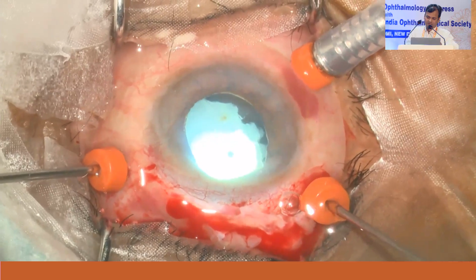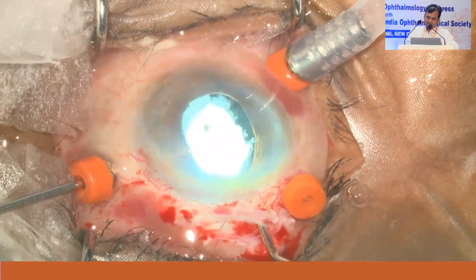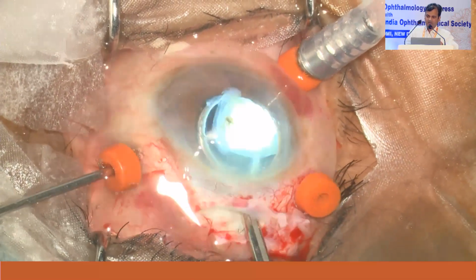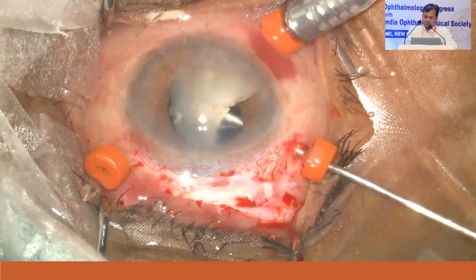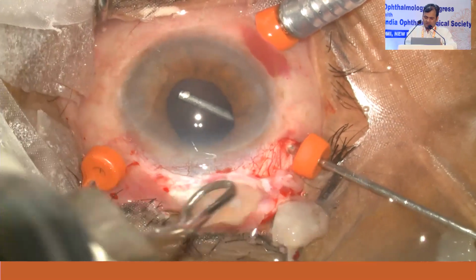And I use here the lens, this light probe, and the cutter. I just pierced it and took it out into the anterior chamber. Mostly I prefer this technique instead of using a phacofragmatome. For a phacofragmatome, you have to enlarge your side port, then you have to use sutures, so this technique also takes less time to remove these pieces instead of clearing with the phacofragmatome.